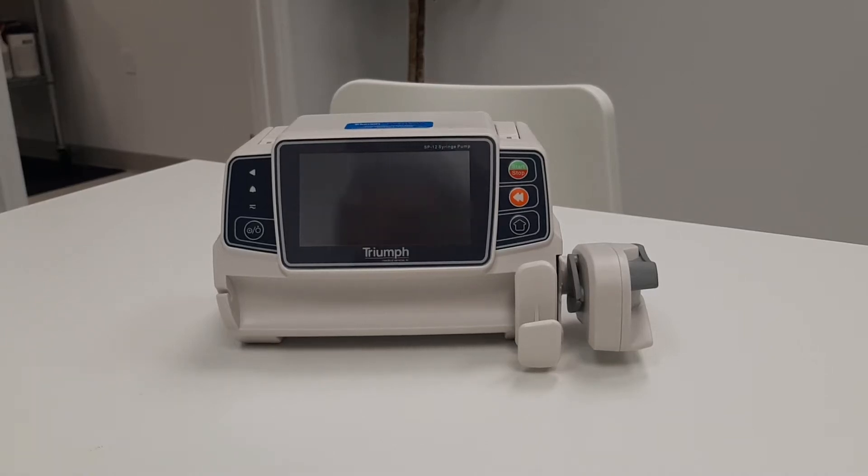This video will explain the basic infusion startup process for the Triumph SP12 syringe pump.